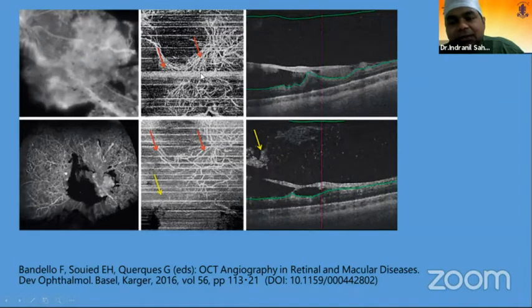You can see the vascular caliber has gone down markedly, but in the corresponding B scan there is a little more noise because of the mixture of the vitreous hemorrhage and the blood that was present under the hyaloid. Basically, an Avastin injection is given pre-op to reduce the possibility of bleed that these patients have when you take them up for a vitrectomy to relieve the traction.